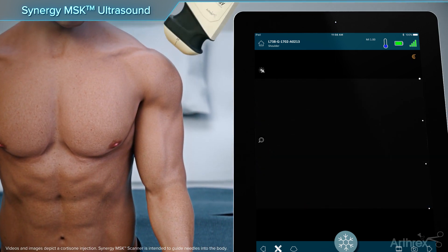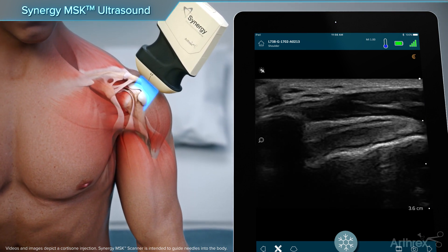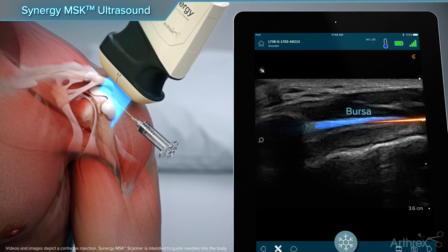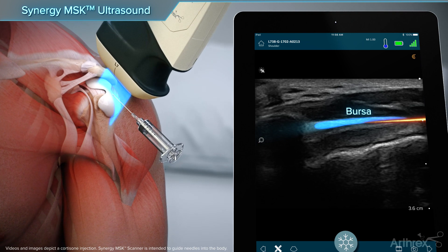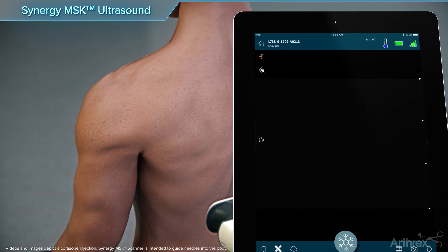To visualize the subacromial bursa, place the arm in a neutral resting position. The scanner is placed just lateral to the acromion. From an inferior direction, the needle is positioned in plane with the scanner at the bursa, outlined by the parabursal fat.